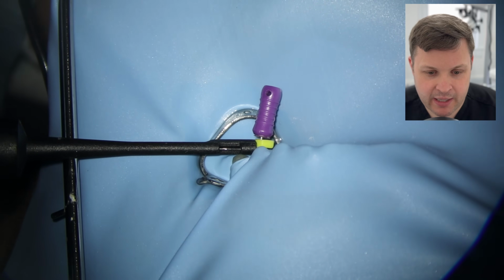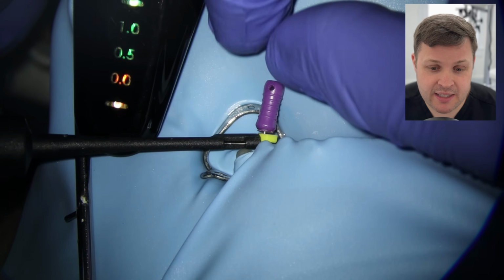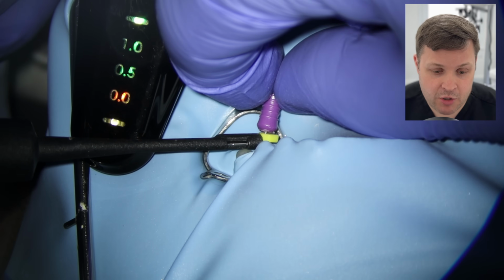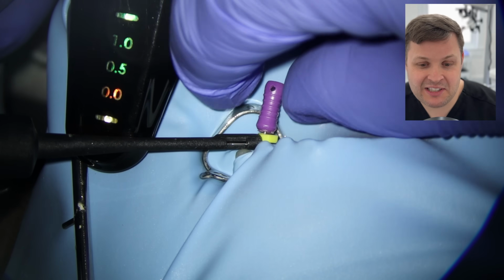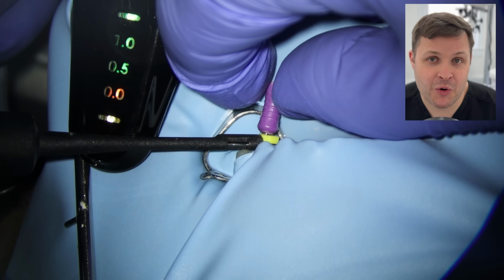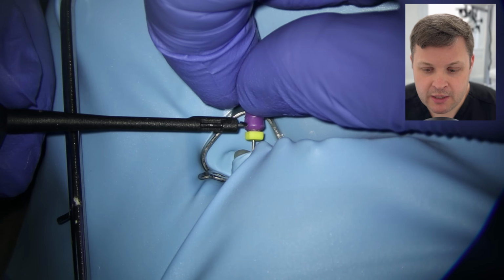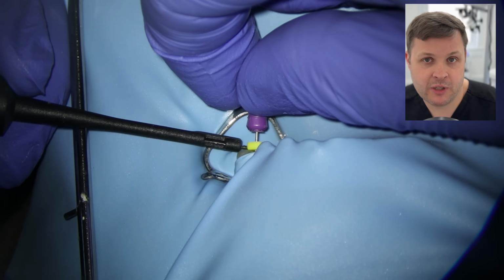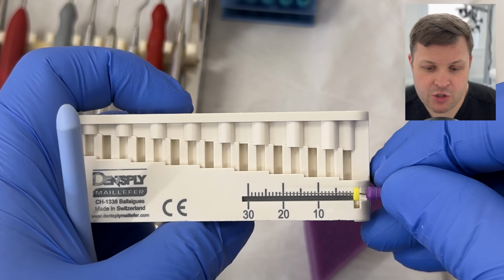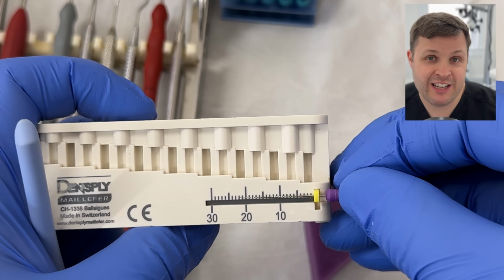on the apex locator. And you might ask yourself, why has the size 10 got to 0 but the 8 didn't? It might be because the higher taper has shaped the canal space and stopped the gripping, or maybe the size 10 is stiffer than the 8. But essentially, who cares? I've got to 0, and it's another one of those hurdles that I've overcome. So again, I'm just going to make sure I'm at 0. I'm going to adjust the stopper, and when we measure the buccal, it's found to be 22 millimeters, and it's only 0.5 millimeters away from the furthest point reached originally with the size 8.